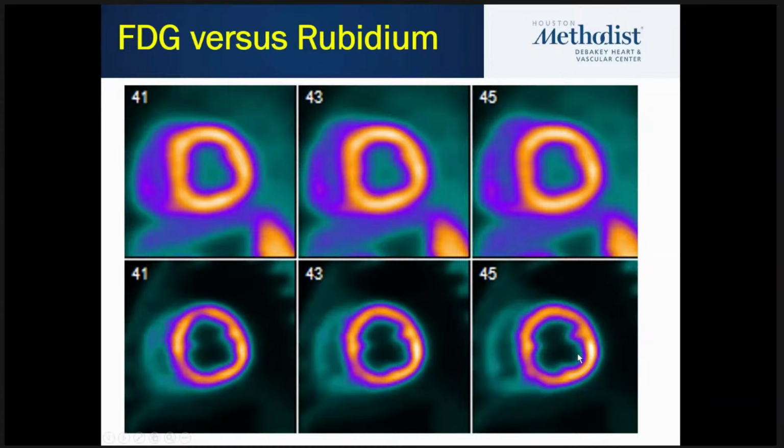So to put things in perspective, this is the impact. The difference between these two images is primarily the impact of the positron range. And that's why if you're going to move from one tracer to another, you have to train your eye to look at different tracers and differentiate what is different between the images just because you are using a different radio tracer.